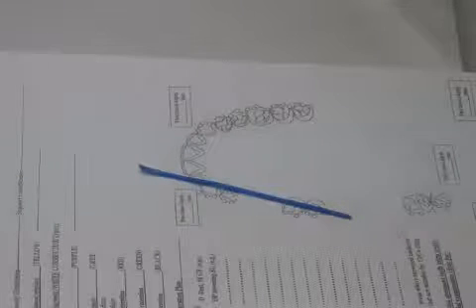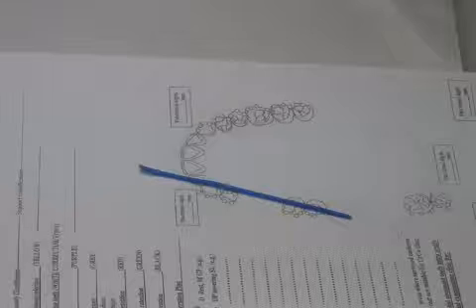I need 2 clasps. I have 2 clasps here. I need 2 clasps here. I need that support to go to the other side as well. I need some reciprocation from the other side and stabilization. So I do extend to the other side. Okay? Now the canine below.